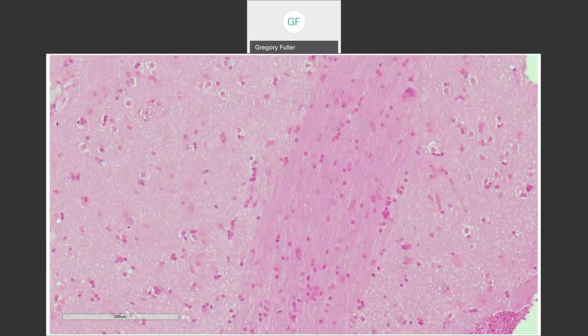It looks like we've got about 3 of the glioblastoma cells on the highway. They hopped on the bus. The pencil bundles here are the bus that they're going to use to get out of town, to better territory. So bottom line, the tissue is telling us this.